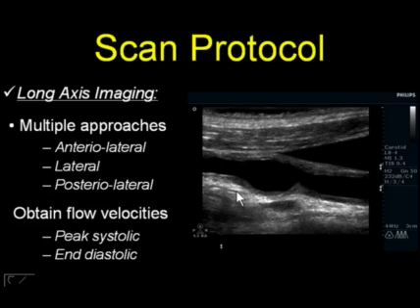For instance, in this patient here, we can see in this long axis image of the common carotid artery near the origin of the internal, and including the bifurcation, that there's some wall thickening seen here in the far wall and on the near wall. Here's a little bit of a moderate plaque at the origin of the internal carotid artery, and we will probably classify this as a mild to moderate homogeneous plaque at the origin of the ICA. And we really use only 4 or 5 words to evaluate plaques.